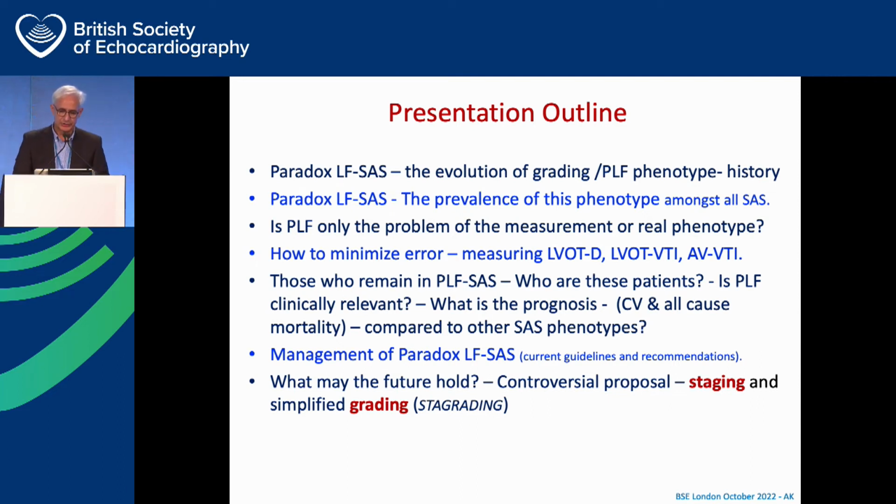I would like to cover also the capture of the prevalence of the PLF severe aortic valve stenosis phenotype, and understand a bit, is this a problem of the measurement, or is it a real phenotype?